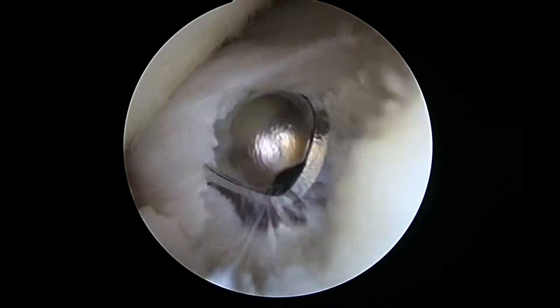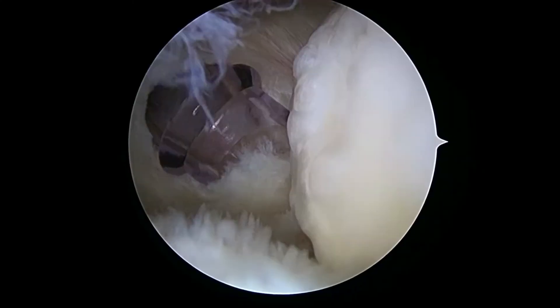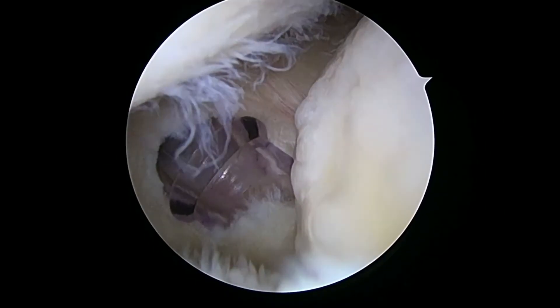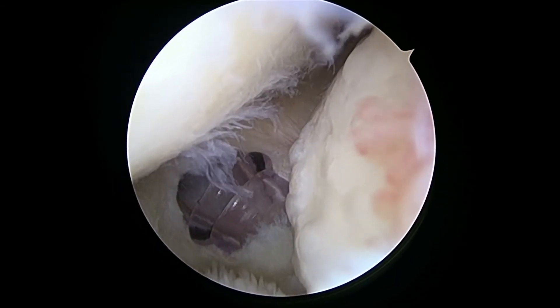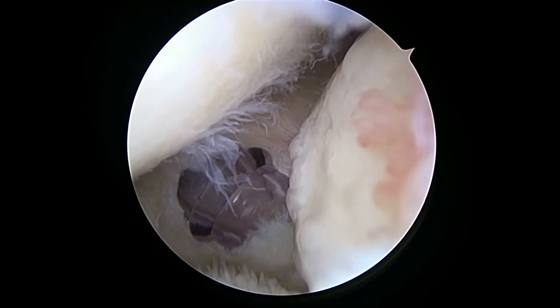All right, Stephen. Here I am trying to open up the space in the back of your knee a little bit to try to see if we could get that out. You can see this cannula is about 4.5 to 5 millimeters — a little bit bigger. And this thing's huge. So I'm trying to see what we could do as far as maybe grinding it down and then taking it out. I'll show you what we do once we figure this out for you.